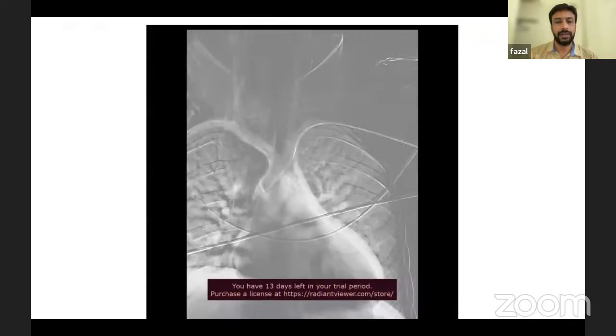You can finish the angiogram, and you will find some difficulty with the SIM2 glide hooking into the right brachiocephalic. Here I do not have the image of the right CCA, but you can see that we have taken a roadmap near the brachiocephalic in the arch, and then through roadmap guidance you can push it into the right brachiocephalic and also into the right CCA.